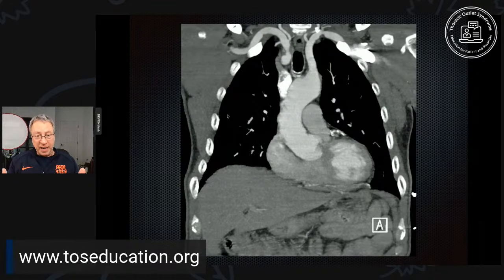If you inject dye, like we do for an arteriogram, you can get pictures like this. We see a curved, large vessel right in the center of our picture. That's the aorta, the large artery in the body. And we see some arteries branching off of it, going up towards the top of the image. These are the subclavian arteries on each side. We can also see the bones are fairly white, bright, and we see that they come into close contact with the subclavian artery on each side. Arteriograms can really show blood vessels quite well and can show them in 3 dimensions.